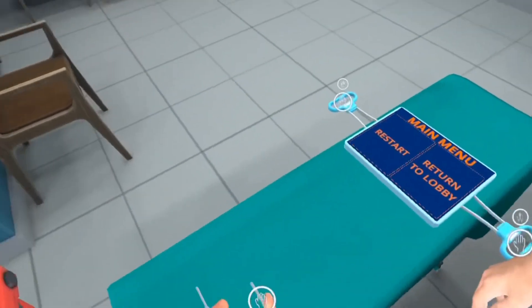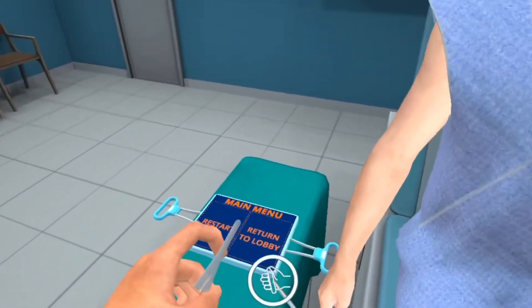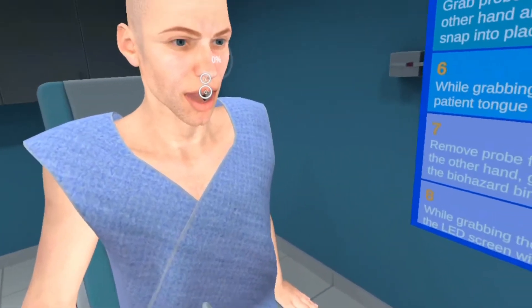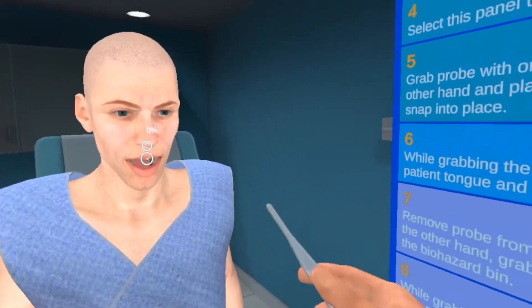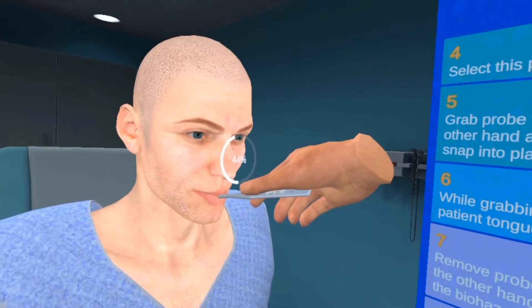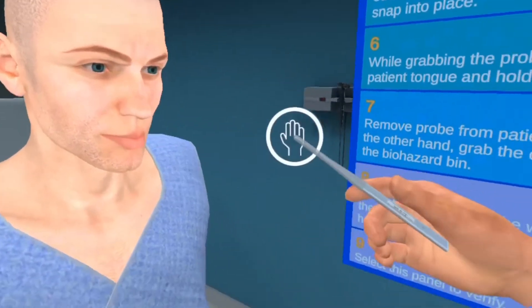Place your probe cover on: click the button with your right hand, use your left hand to place the cover, then let go of the left hand and keep holding the right one with the trigger button. Then have the patient open their mouth, take your probe, and place it under the tongue until you hear the beep.